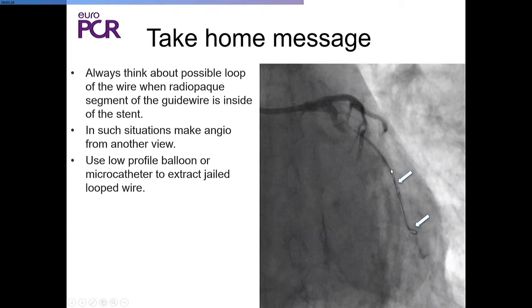What about pulling a buddy once you are pushing the stent? The stent had already reached. Could you have already pulled the buddy before you deployed the stent? Yes, before.